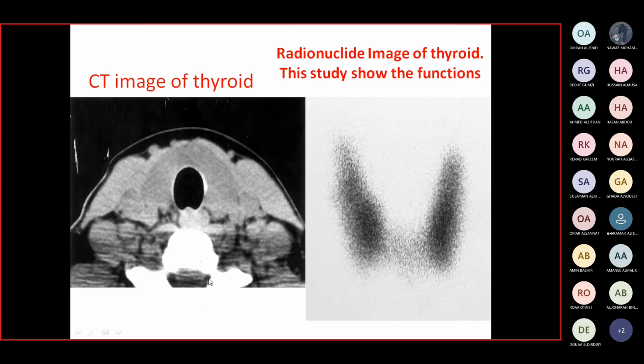What is this imaging modality? CT scan. Why? Because you see the vertebrae is very white. Yes, thank you. You can see the vertebrae is very white, or very what in CT? Dense? Yes, thank you. This is very dense vertebrae in CT.